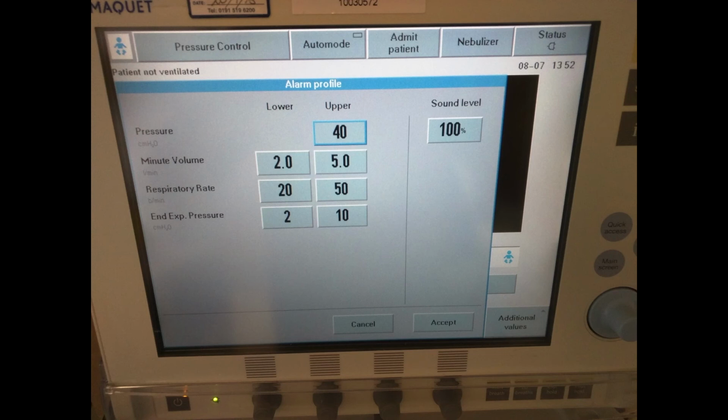volume. So you can see what the ventilator does. It protects the lungs by not going more than 5 below the upper pressure limit. So it delivers the volume, providing it can do safely, and if it's getting into high pressures, then the volume is limited. So you can see 40 is far too much. You don't want to be using pressures of 35 before the ventilator tells you about it. So I would normally have this set somewhere between 30 and 35, so the ventilator will start telling me once the pressures go above 25 or 30.